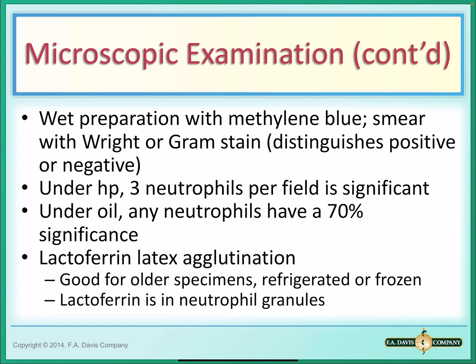We can also do a lactoferrin latex agglutination test. A lactoferrin latex agglutination test is available for detecting fecal leukocytes and remains sensitive in refrigerated and frozen specimens. The presence of lactoferrin, which is a component of a granulocyte secondary granule, indicates an invasive bacterial pathogen.